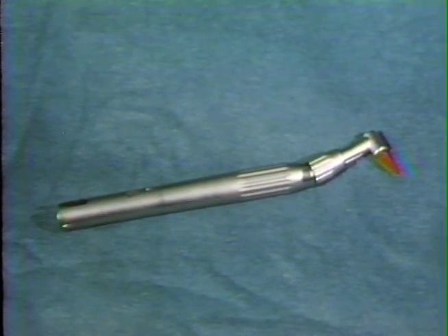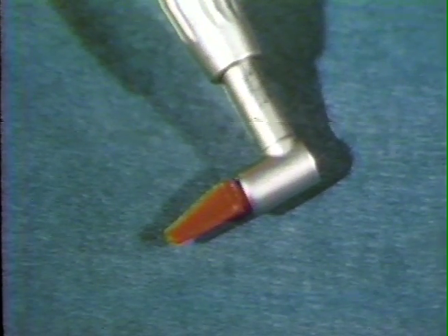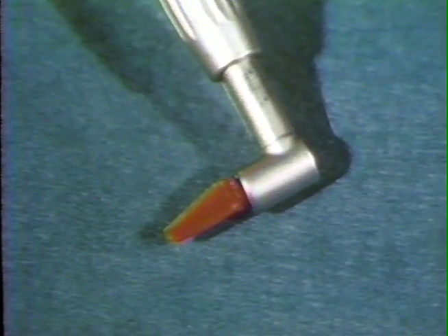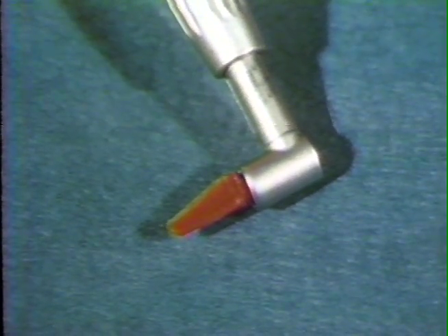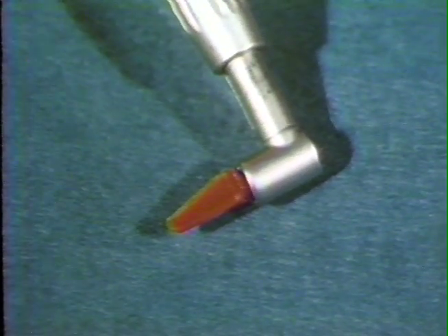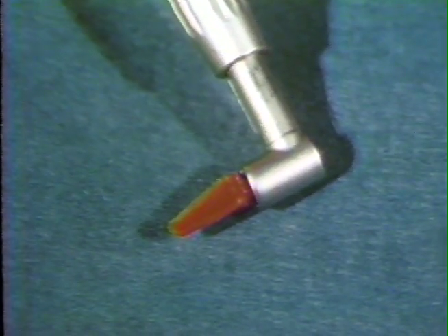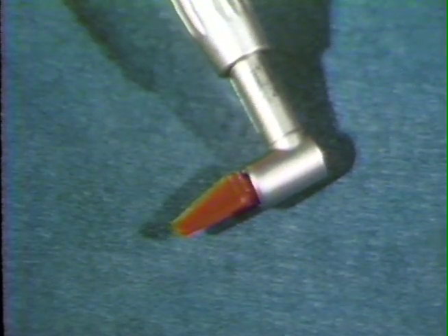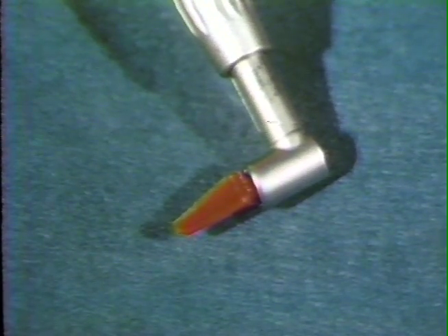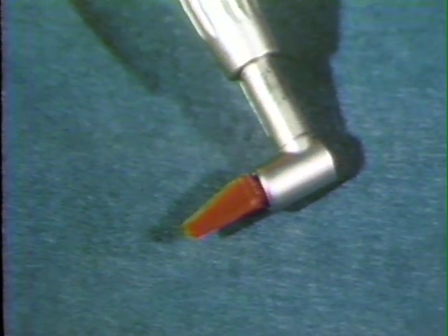A new polishing contra-angle, which provides a back and forth action of the tip, has recently been introduced for polishing interproximal surfaces. It is called the EVA system for prophylaxis and can be attached to a regular handpiece. The tapered triangular plastic tips have a series of cross-cut grooves to hold polishing paste. Different size plastic tips are color-coded.